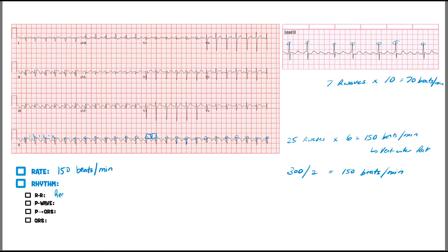Next, let's look at the P wave in lead 2 — it has to be upright. I'm having a hard time finding the P wave. There might be something, but it doesn't look like a characteristic P wave. If anything, it's kind of pointed — sawtooth in nature. In AVR it's supposed to be inverted, but I don't really see a clear P wave there either. So again: no clear P wave — go to V1.